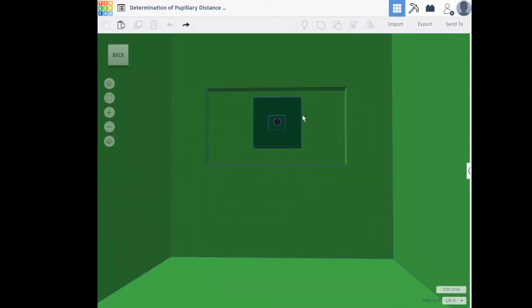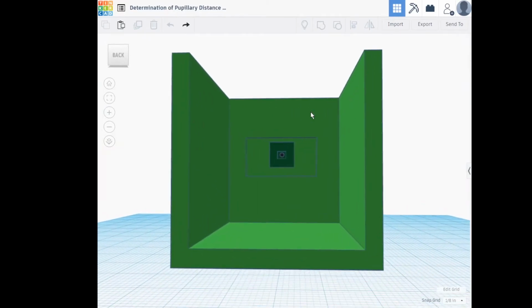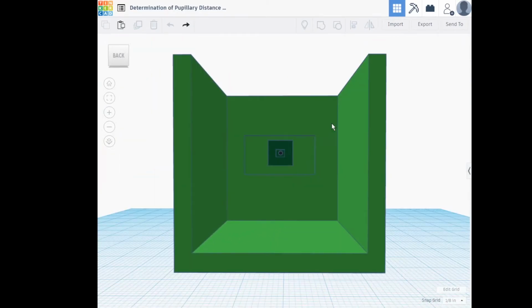In the back side, there is a pinhole type camera of the prototype. This is responsible for capturing and analyzing the images of the patient or the subject. Once the subject would use it, they would have to place their face, their chin or nose near the bottom part of the prototype and align their eyes with the camera.